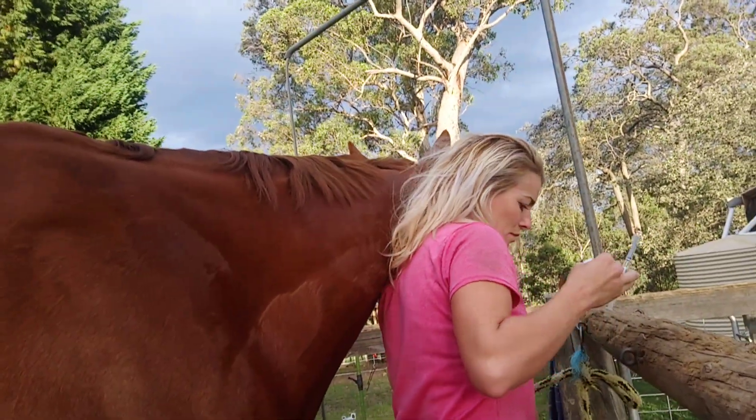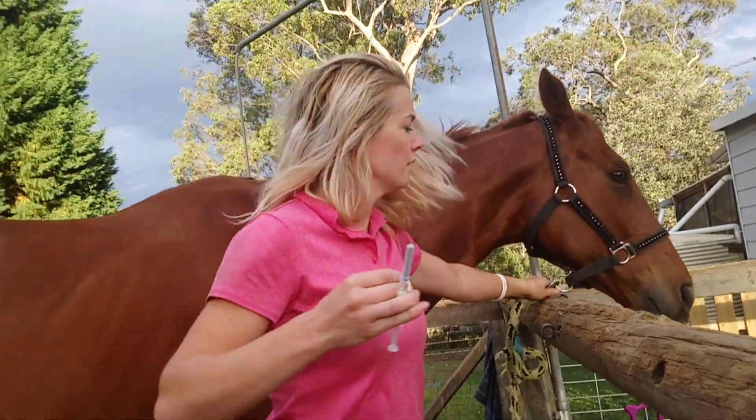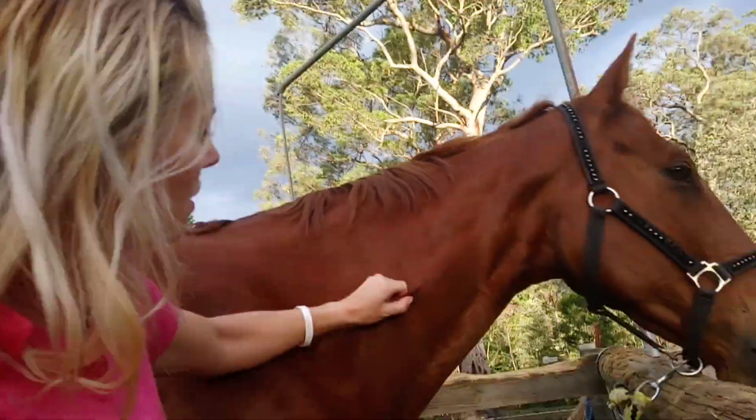I'm just going to move him around so we're going to have a good look. So what we're going to do with the subcutaneous injection is we're going to have to pinch a bit of skin like that.